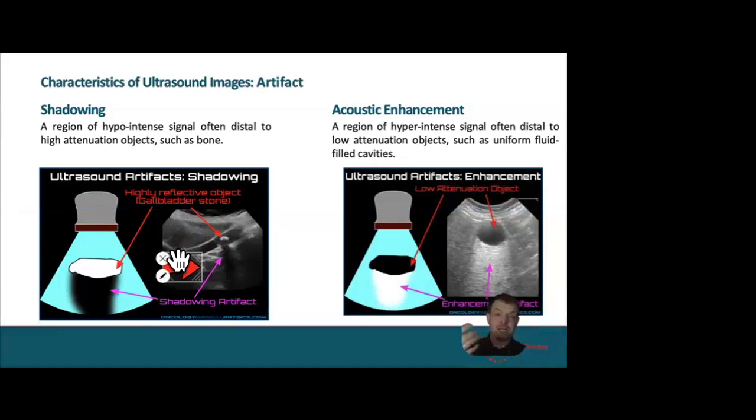So if you've got a calcification in a tendon, for example, if you're looking at the Achilles or you're looking at supraspinatus and you think that there's a calcification there, if there is, it will block the ultrasound passing through it. So you won't be able to see the structures underneath that calcification. Okay. But the good thing with musculoskeletal scanning is you can move things around. Yeah, so if I move the tendon around, then I can see whether the calcification moves with it, or if there is a hole underneath, basically. So is it a tear, or is it because the calcification is blocking? And by moving around, you can assess that.